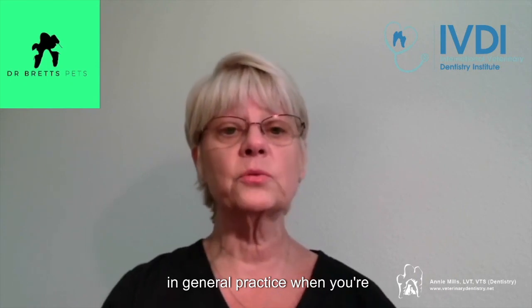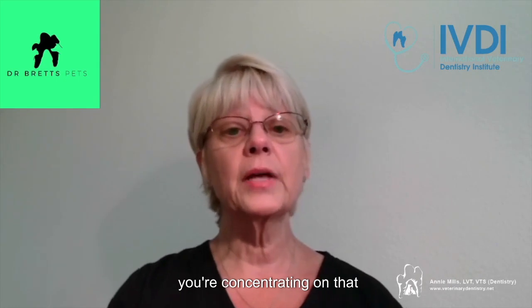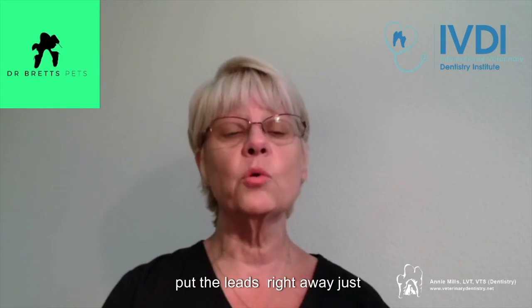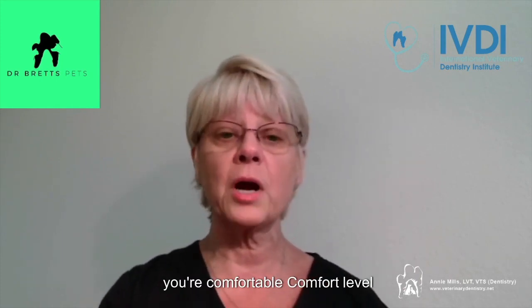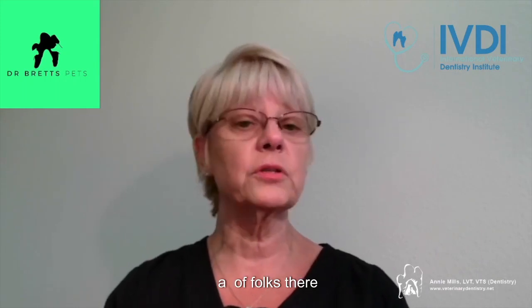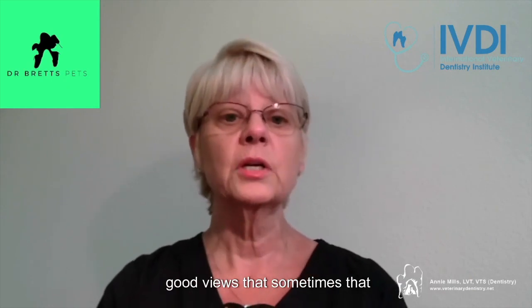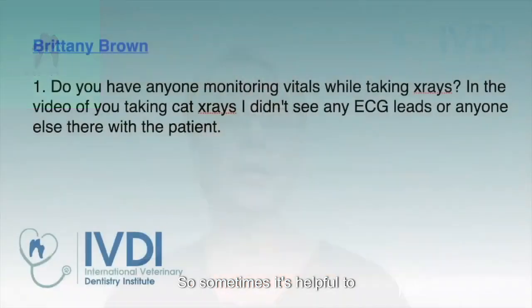Now, in general practice, when you're taking x-rays a little bit longer, you're concentrating on that. Yeah, you might have someone who's helping you during that time, or put the leads on right away, just so your comfort level is a little bit better that the patient is monitored, because a lot of folks are concentrating so hard on getting x-rays and getting good views that sometimes that takes all of your attention. So sometimes it's helpful to have help. All right, good question.